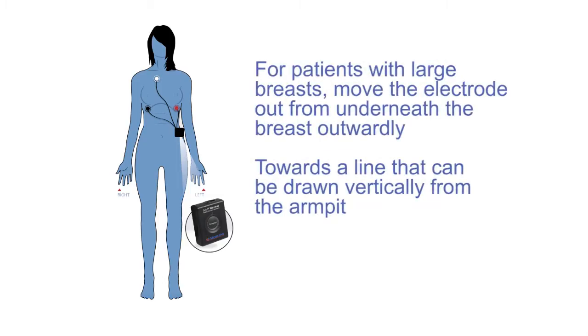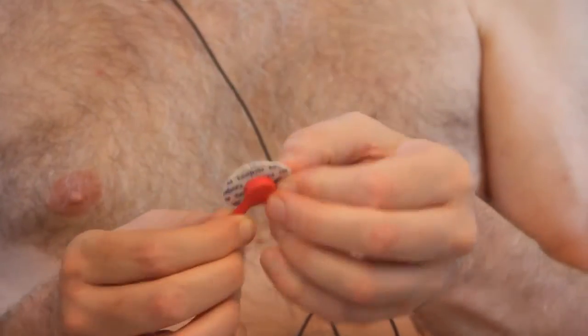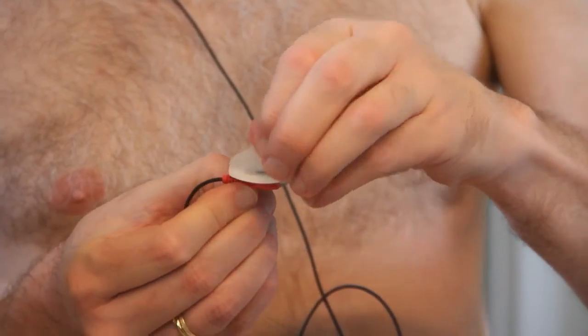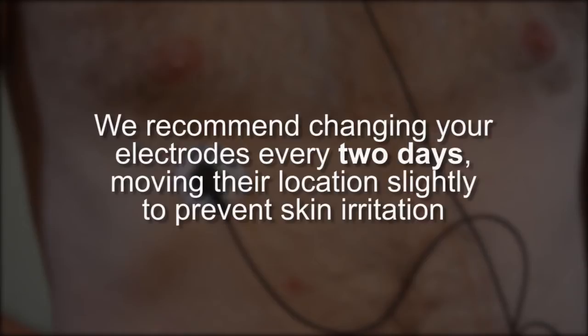For those with large breasts, move the electrode out from underneath the breast more outwardly towards a line that can be drawn vertically from the armpit. Finally, take the wire from the red terminal and snap it onto one of the electrode patches. Peel it from the plastic backing and apply it to the lower left, opposite the black one. It should be applied in the same position as the black but on the opposite side. We recommend that you change your electrodes every two days, moving their location slightly to prevent skin irritation.